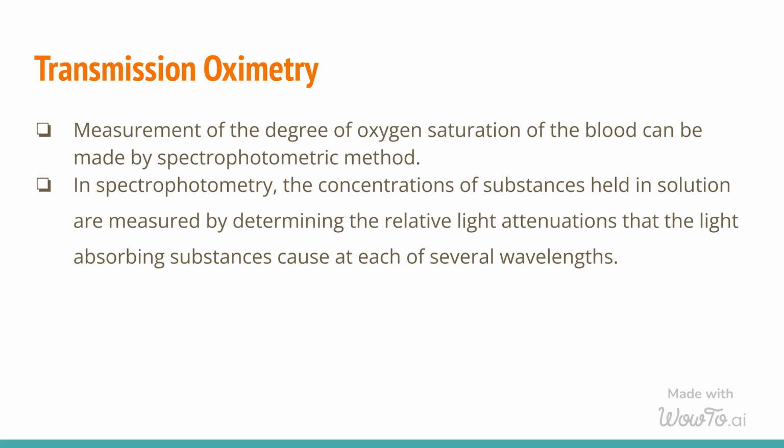This technique is commonly used in medical settings to monitor oxygen levels in patients, particularly those with respiratory or cardiovascular conditions.